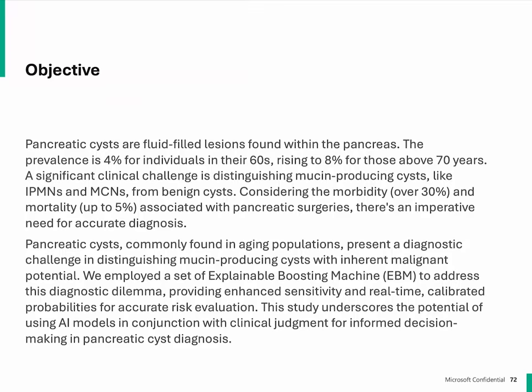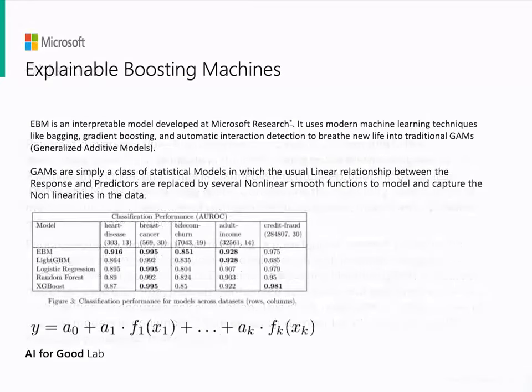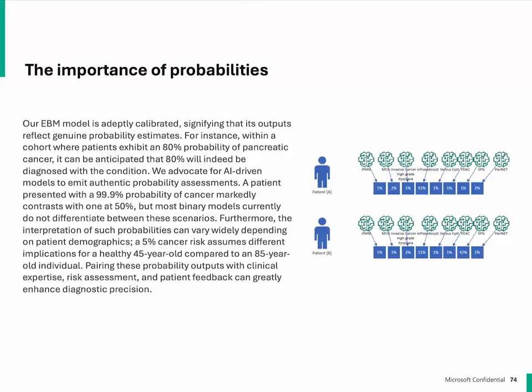Again, most of them are benign. How do you decide who to manage? Well, using explainable boosting machines, which have been used for things like heart disease and breast cancer and telecommunications and credit card fraud, what EBMs do is you can see exactly why the computer is making select decisions. And it works very well for medical.